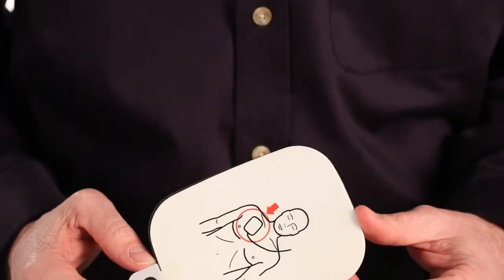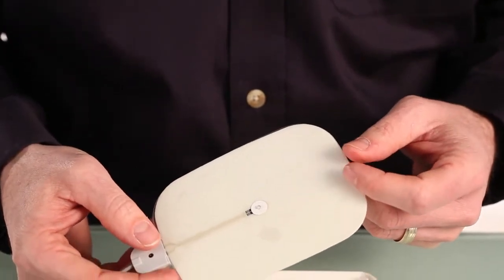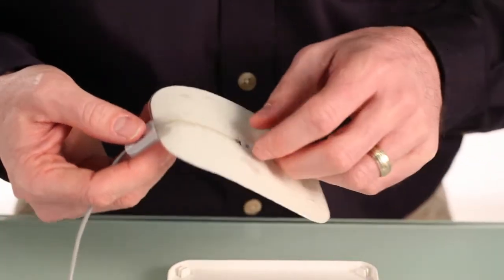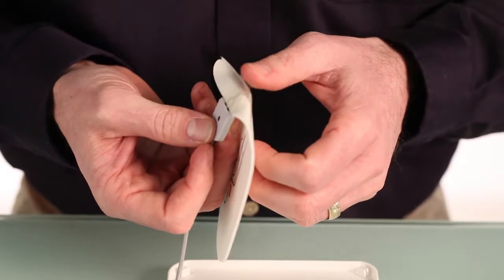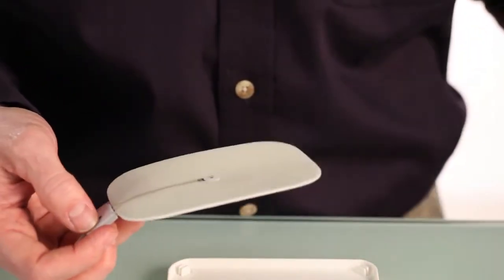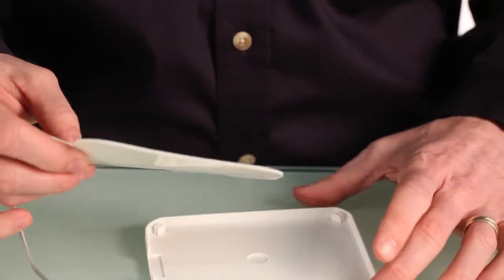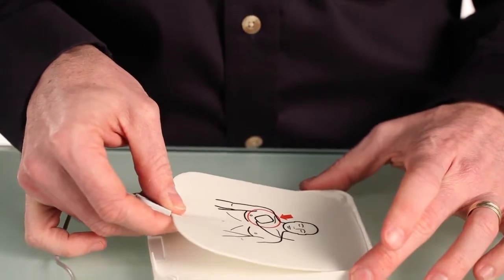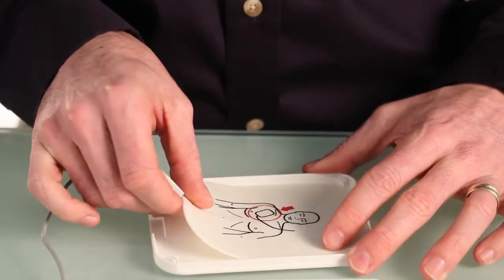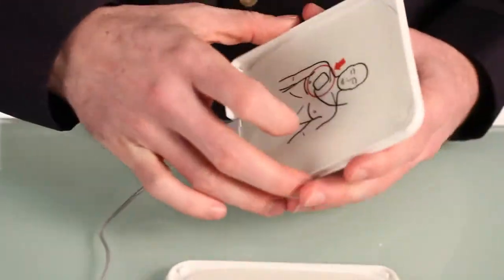There is a clear plastic liner on the adhesive side of the pad. To remove the liner, turn the pad over and gently push down on the connector, which will cause the liner to separate from the pad. Make sure to throw the liner away. Then adhere the adhesive side of the pad to the inside of the white plastic case, ensuring that the edges are lined up. Then close the pads case.